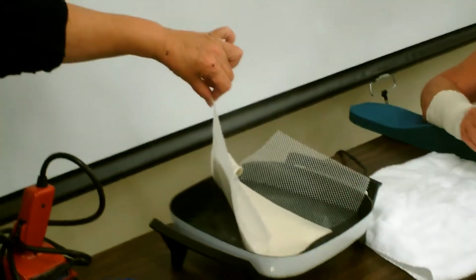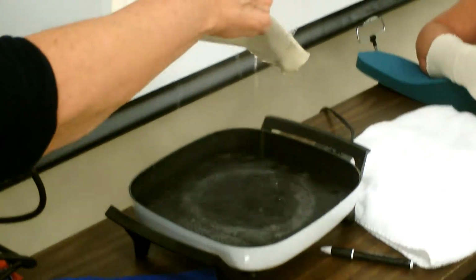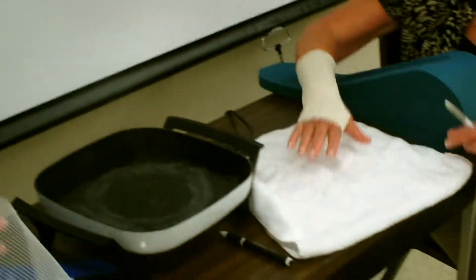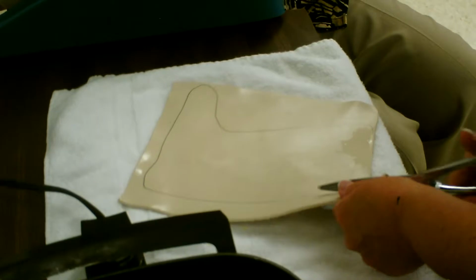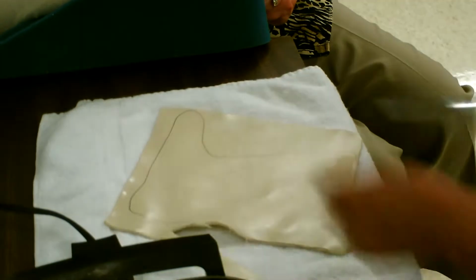Okay, so now the material, look, it's all gooey. It's like soft. You've got to be careful that it doesn't roll over onto itself. You take the netting, and some people do this. Certain materials will stick to the towel, and I sort of just cool it down. You need confident cutting, because if you don't, you're going to get jagged edges. Look at that on the tape. You don't want that. Hold this. All right?